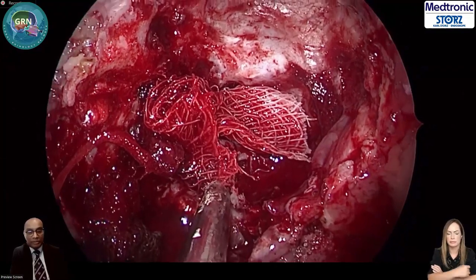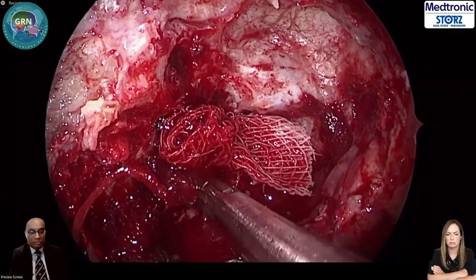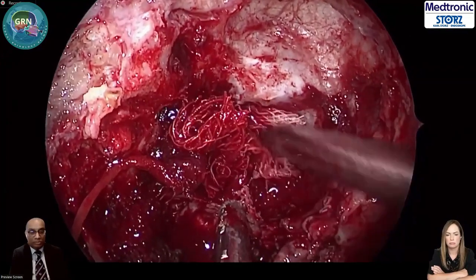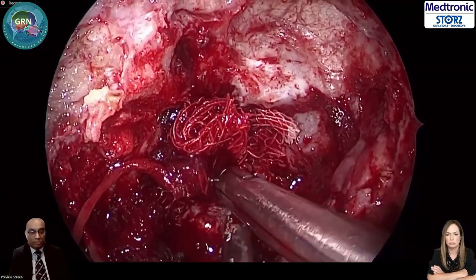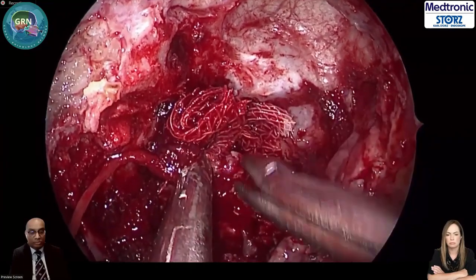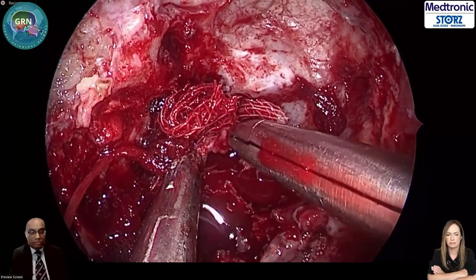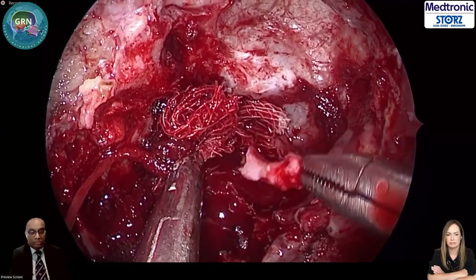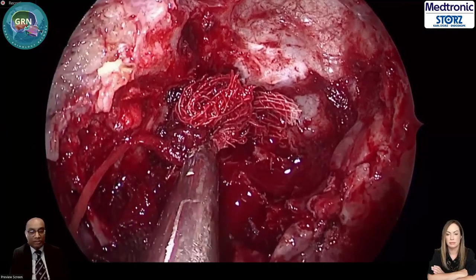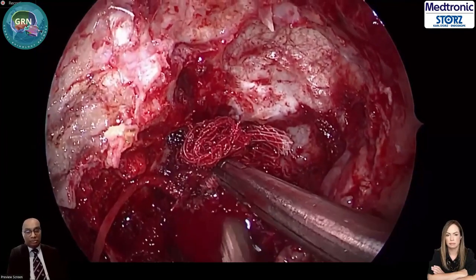These are all the small JNAs which will go into the Haversian canals. And if you don't drill it, believe me, this is going to lead to recurrence. This is what we studied. And see again, there's one JNA hidden here. Can you see that? These are the small ones which will create recurrence and not the big one which you drill.